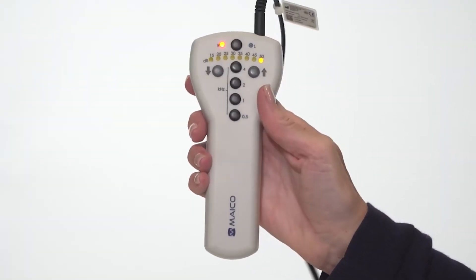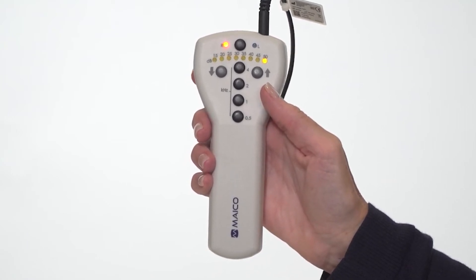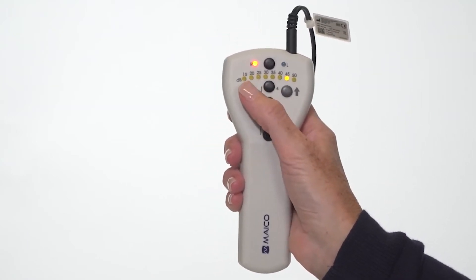The MA1 has four frequencies available to test and a reduced volume range specific for hearing screenings. Set the volume level by using the left and right arrow buttons.